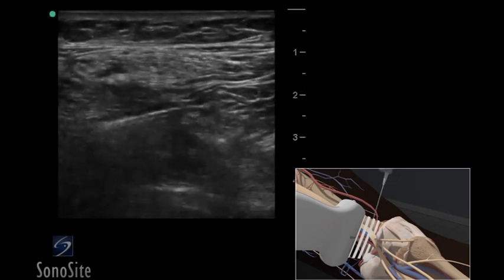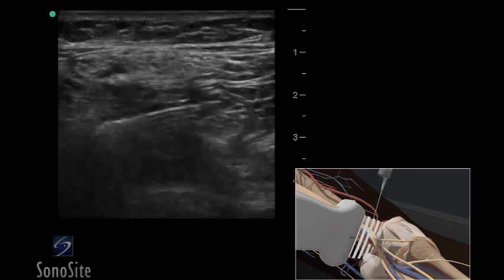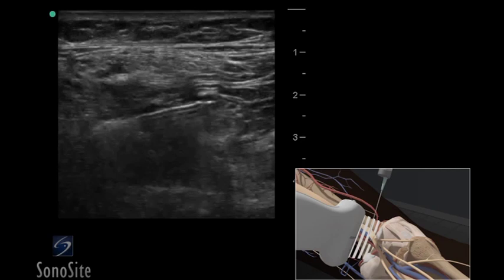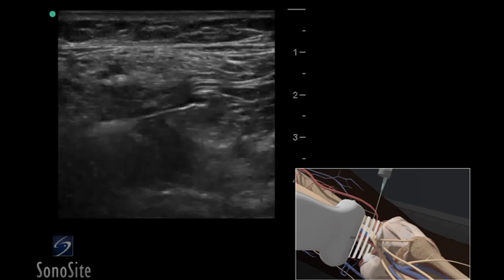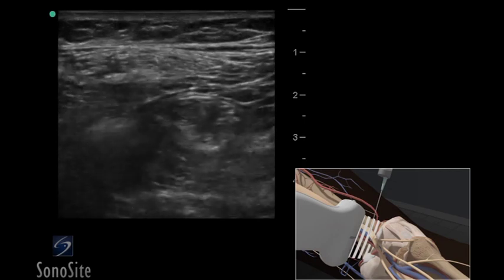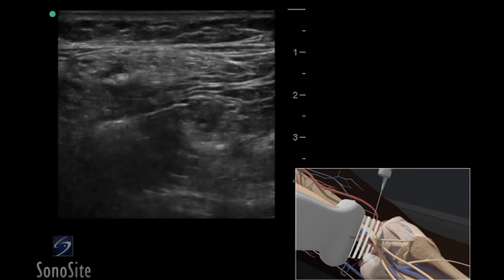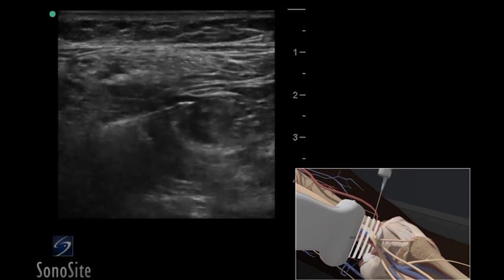The needle is advanced using an in-plane technique. The needle is positioned 1 to 2 centimeters lateral to the transducer and advanced under the transducer. The initial endpoint for the needle is immediately beside the tibial nerve. Local anesthetic should be principally injected around the tibial nerve, as it is responsible for the majority of the innervation of the foot.